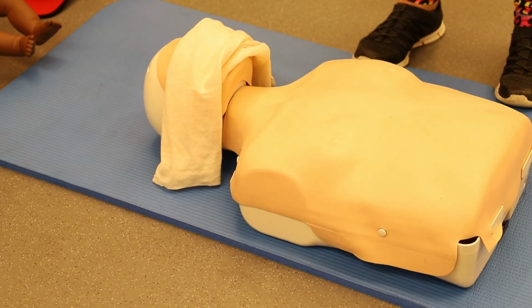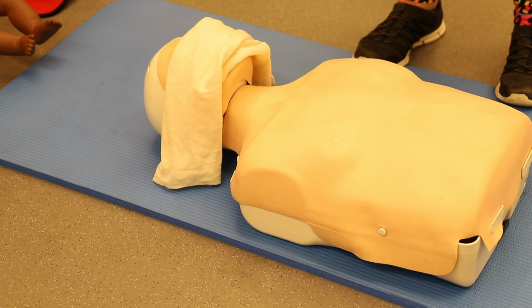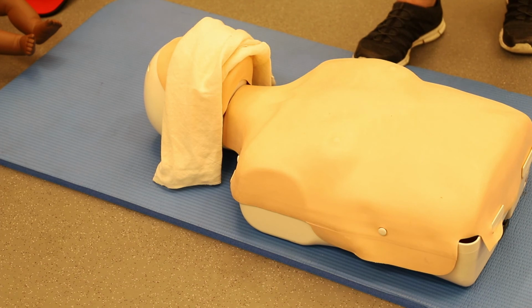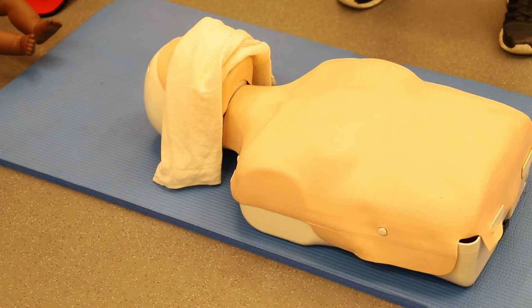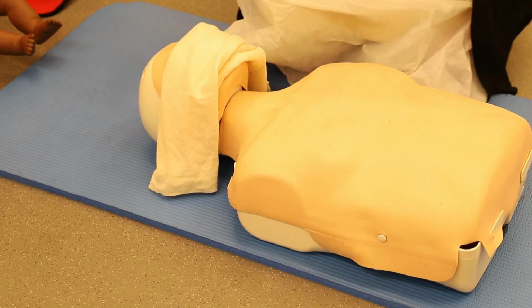So I'll do this from a distance and I'll be looking at their chest and I'll be seeing if it's rising, and I'll still be doing that for the 10 seconds. 1, 2, 3, 4, 5, 6, 7, 8, 9, 10. It appears that my casualty is not breathing, so I do need to come down, make sure that I've got my mask on and keeping myself safe.